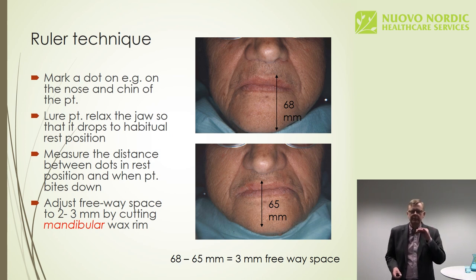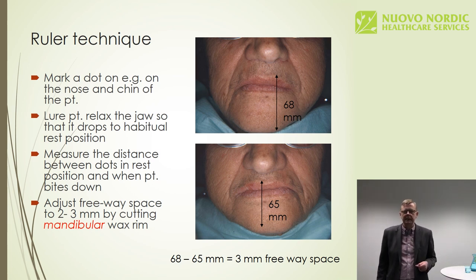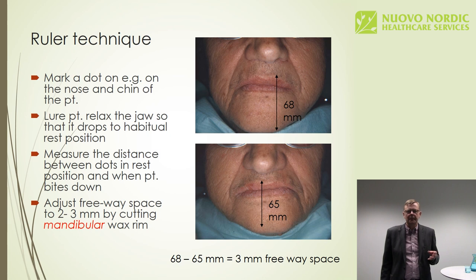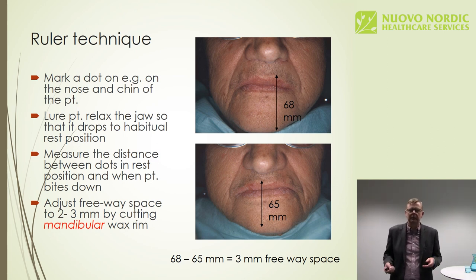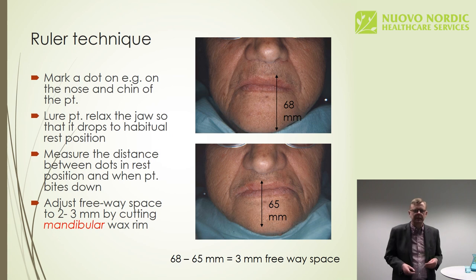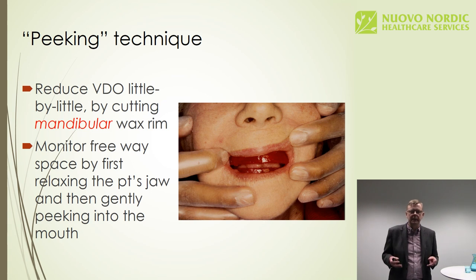We can measure the distance between the occluded wax rims and the relaxed habitual rest position. As you can see, the soft tissues do not exactly or accurately express the difference, because the soft tissues tend to move a little bit anyway, but you will have an impression of a couple of millimeters of freeway space. So you can do it by measuring the distances, or, and this is what I used to do, I cut the wax rims in order to have the proper freeway space.